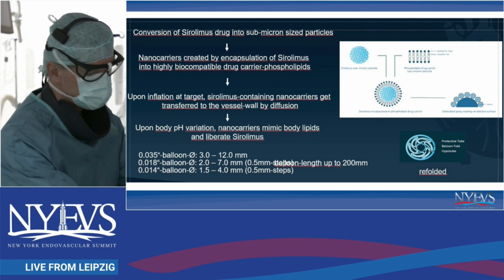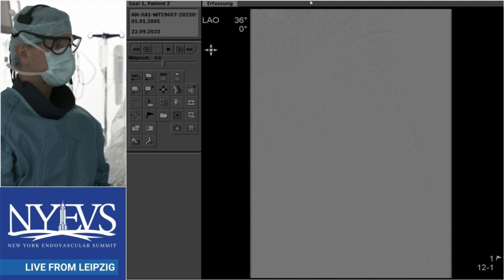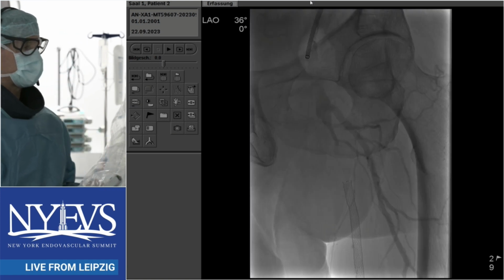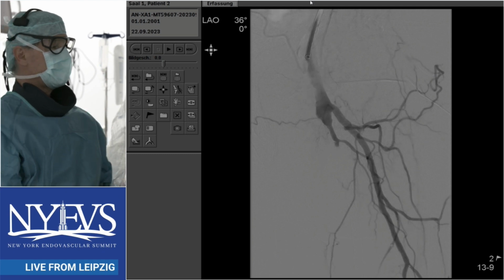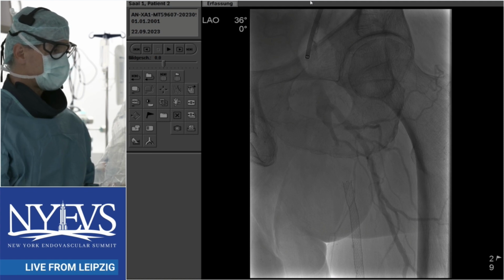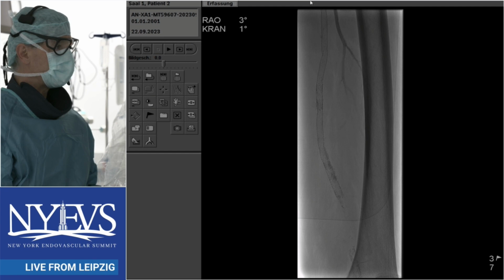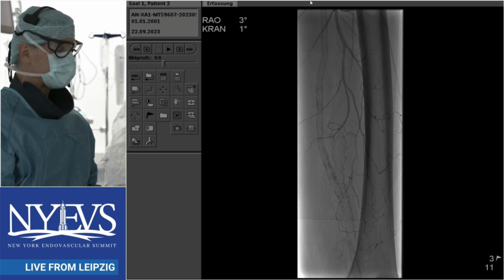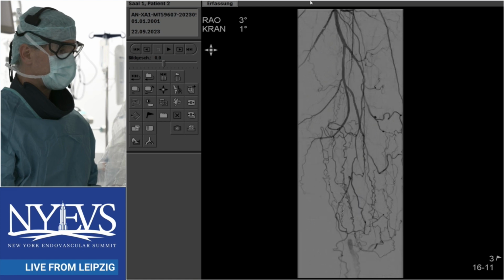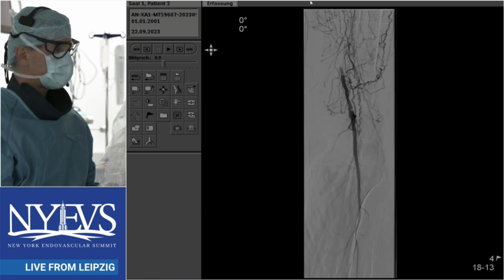Let's switch to the angiography, and Manuela went already crossed over. Can we switch to angio? So, 8 French. We could also go antegrade down, but after several surgeries here, maybe a little difficult. That is probably the stump into the SFA. Here now the stent. And then the whole length is totally occluded. I cannot see here really a major stent fracture. We don't know which stent this is. That was also done in another hospital nearly 6 years ago. And also distal, an area where there's no stent but native artery occluded. Further down, complete.